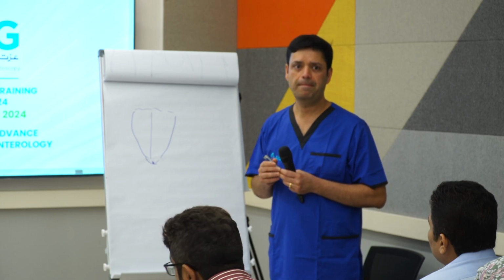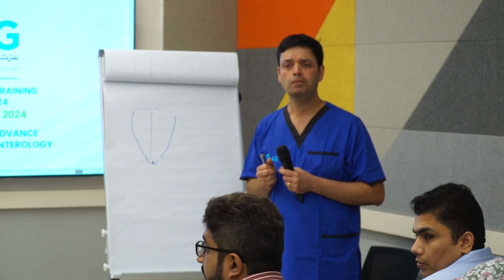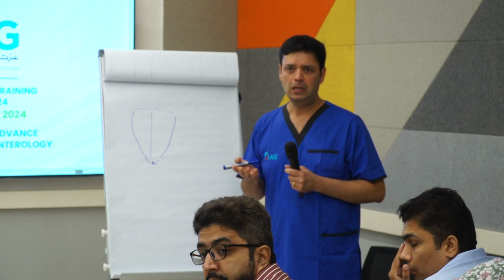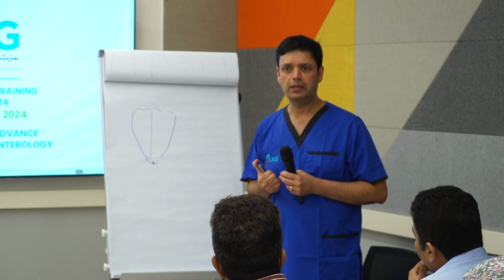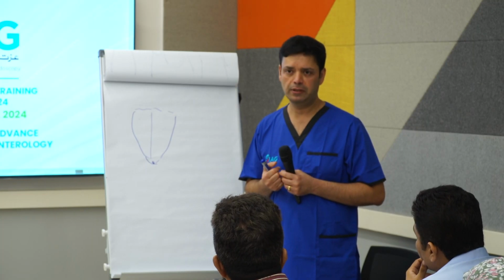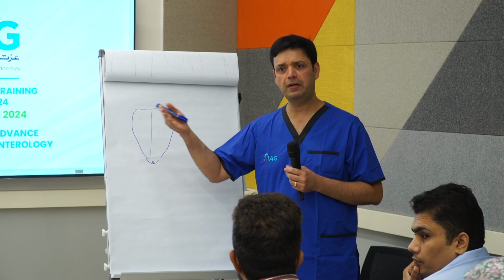And then when do you remove it, if you find it is a benign stricture? How much time did you give them? Normally we give about 2 to 3 months, so it remains there for 3 months. Can you take it out easily? Yes, fully covered comes out. Even we can leave it actually for 6 months as well.